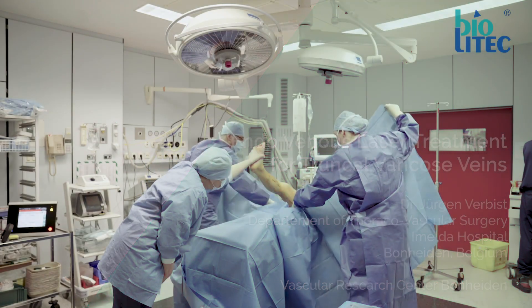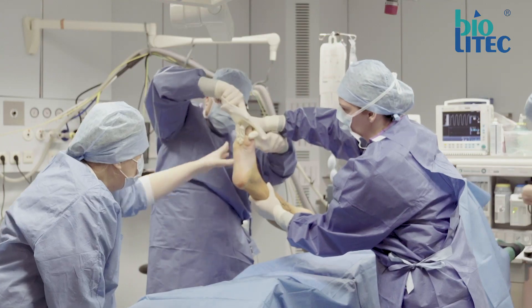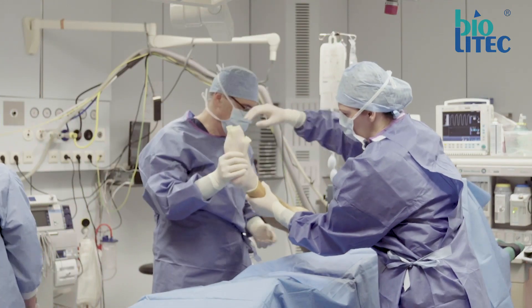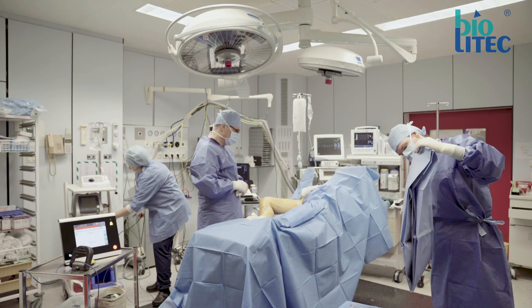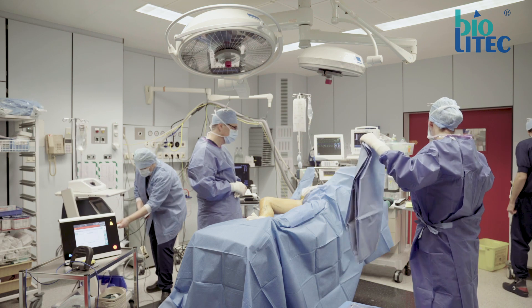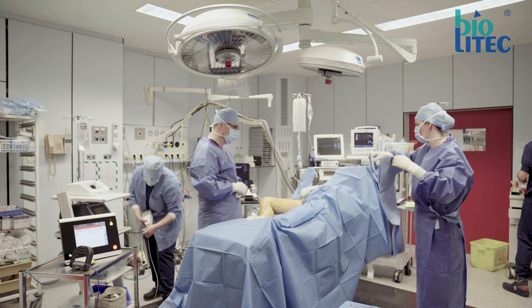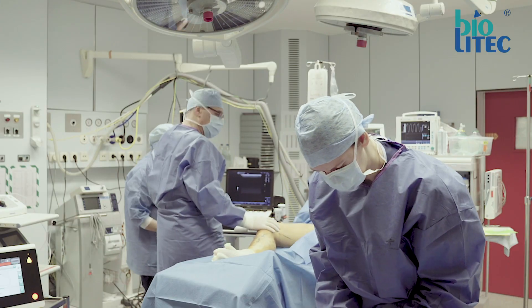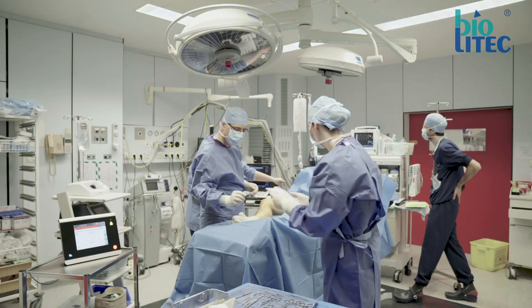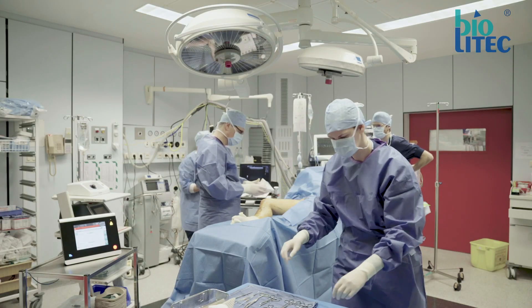We have been using endovenous laser therapy as an alternative to conventional crossectomy and stripping for almost 20 years now. Over time, the diode lasers used as well as fiber technology have changed considerably. This has resulted in EVLT becoming the new golden standard for truncal varicose vein treatment, and I would like to show you how we perform this procedure nowadays.